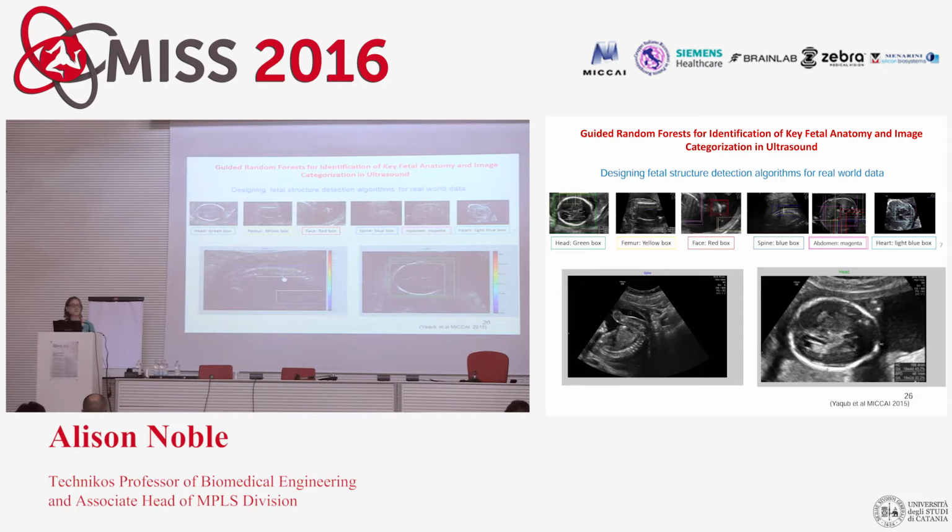If I now go back to this example, the boxes that you might be able to see, there's a blue box here that says it's found a candidate spine. The yellow one says it's found a candidate femur. What you find on spines, if I run it, is that there are quite a lot of structures, for example that yellow one there, that do look a bit spine-like. So it goes through the process here, you've got straight lines, and then it will go through the process of doing the hypothesis and eventually finds the right object.